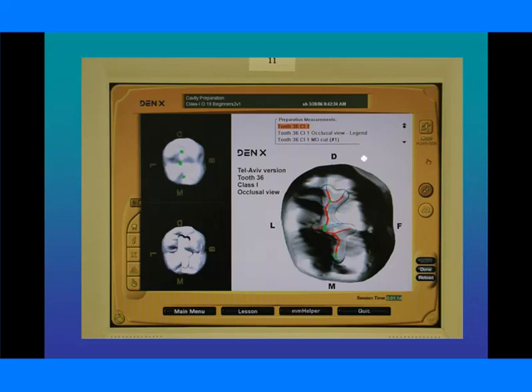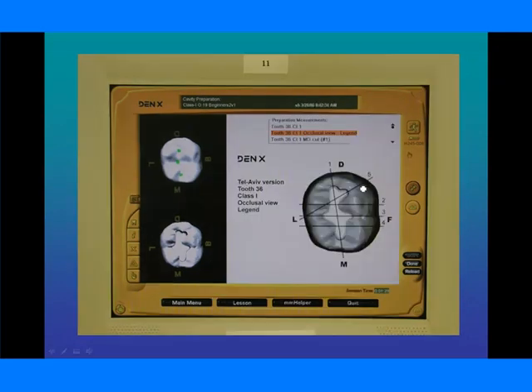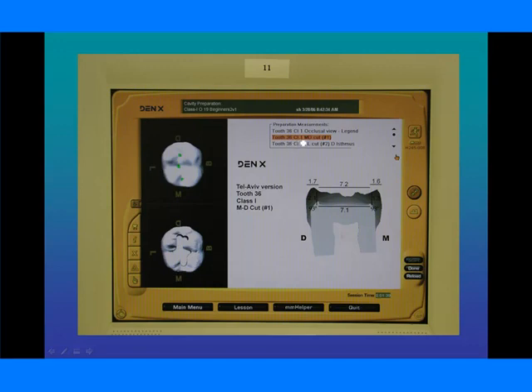Now I'm going to go through the different cross sections here. You'll notice we have 5 different cross sections. The first cross section is our mesial distal cut, and that cut goes from the mesial to the distal through the center of the tooth. You'll notice the length of our preparation is 7.1 millimeters, the depth is basically 2 millimeters, and our wall angulation is 93 degrees, which tells us that these walls slightly, what we call, diverge. This is another term that I want you to understand. This is a term that will be used through the operative course.